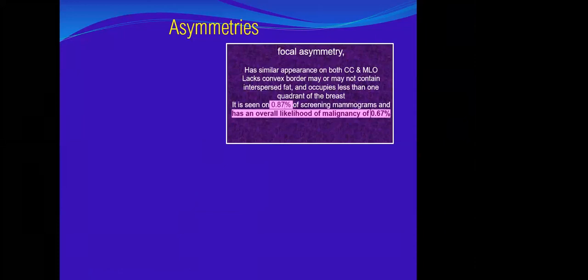And the focal asymmetry has been seen in less than 1%, about 0.87% of screening mammography, and has an overall likelihood of malignancy of 0.67%.